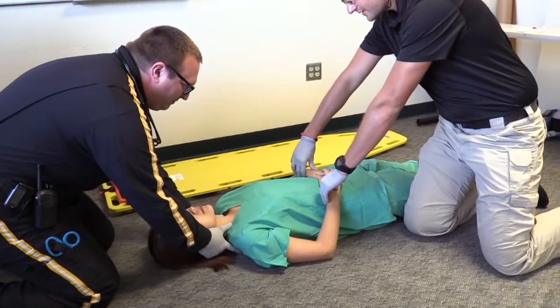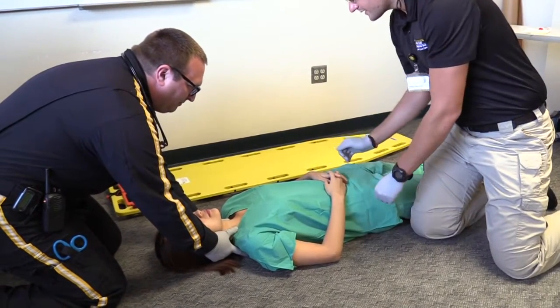I will then ensure the patient has good pulse, motor response, and sensation in all extremities.